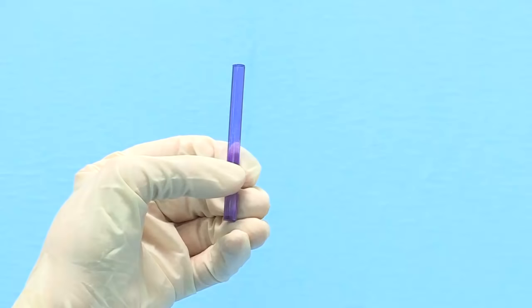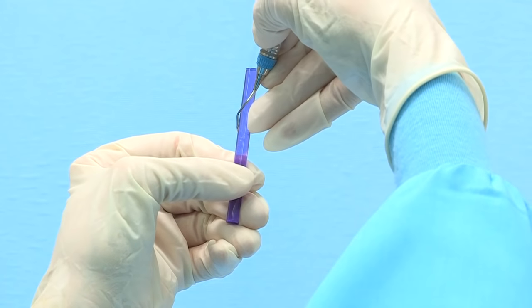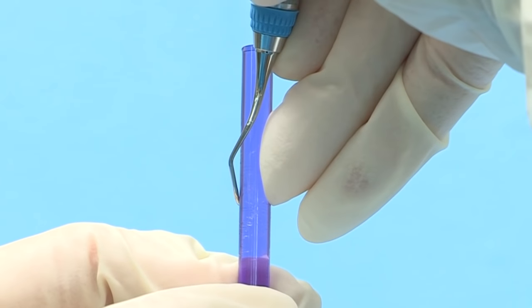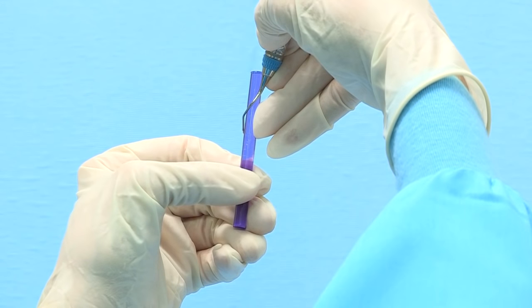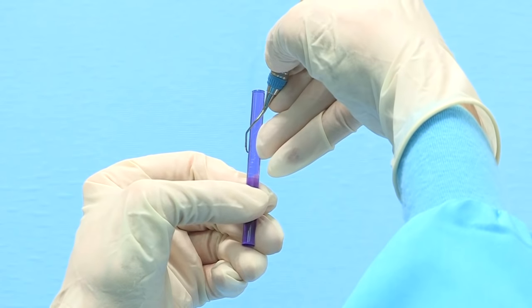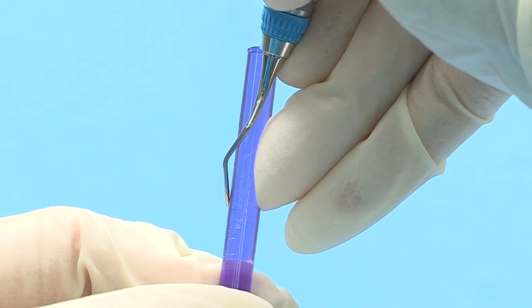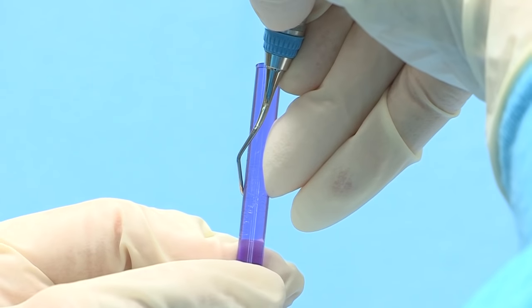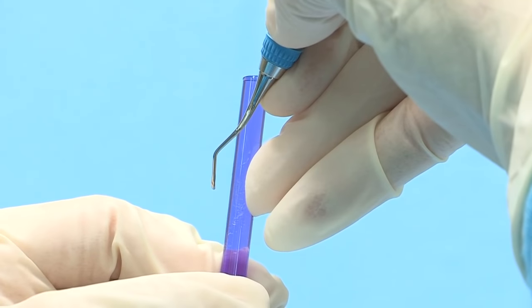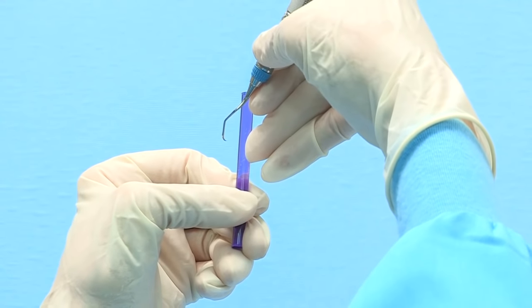Testing the even-numbered Gracie curette for sharpness is easy because the downward slope of the blade automatically positions the cutting edge at the correct position on the test stick. The terminal shank and test stick will both be at 12 o'clock. In your dominant hand, hold the instrument with a modified pen grasp. For even-numbered working ends, the toe will be pointed away from you. Place the cutting edge against the left side of the stick, and place your ring finger on the opposite side to act as a fulcrum. Press the cutting edge into the test stick and release — if sharp, it will bite or grab the stick and you will hear a metallic sound or ping. Be sure to test the entire length of the blade.